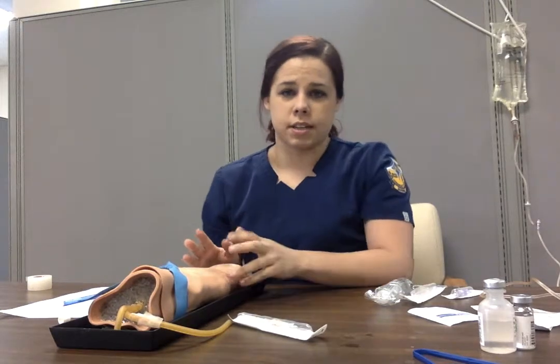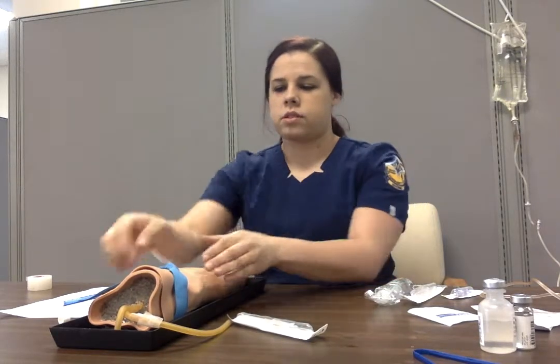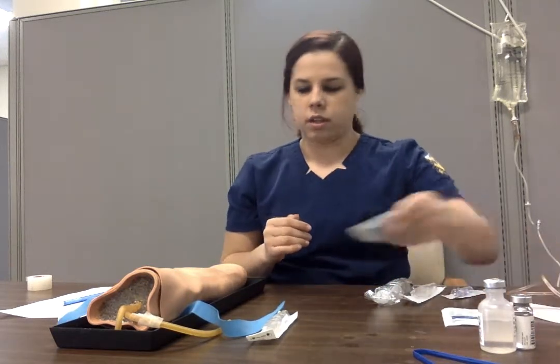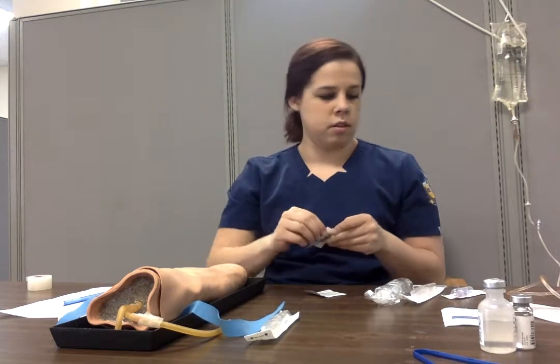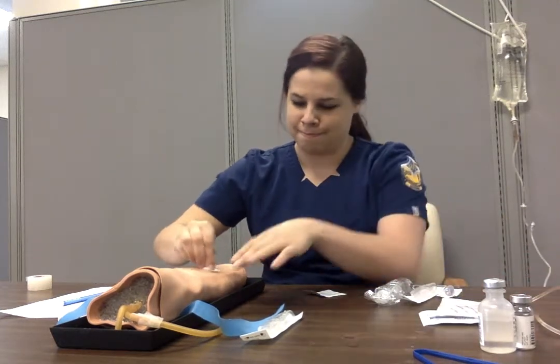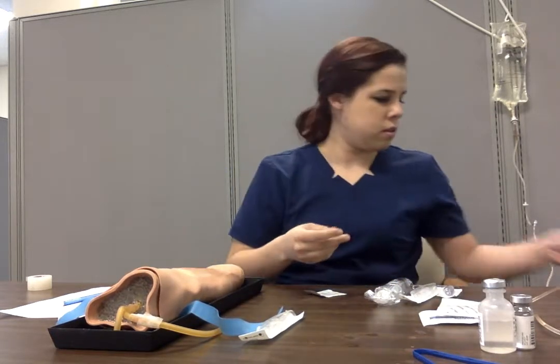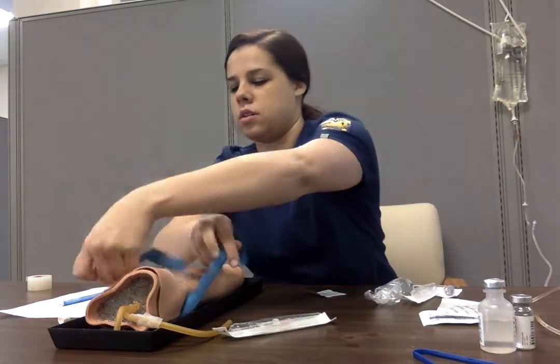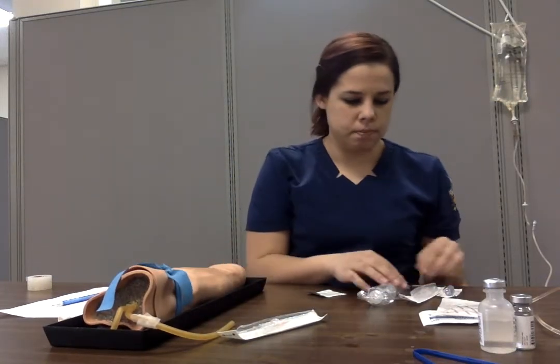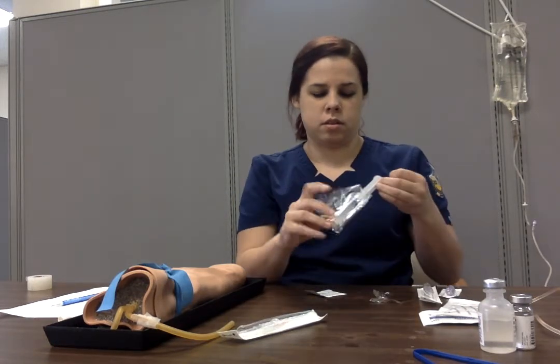And if I couldn't, I would need to take the tourniquet off, reapply it, and looser, not so tight. And so I found a pulse, so I'm going to release that. And I'm going to wash my hands, put gloves on, clean the IV site. And I'm going to put the tourniquet back on. I have my gloves on. I'm going to get all my stuff set up so it's ready.